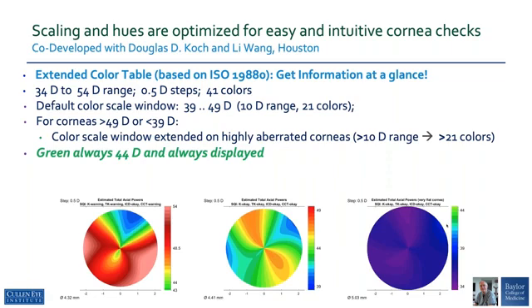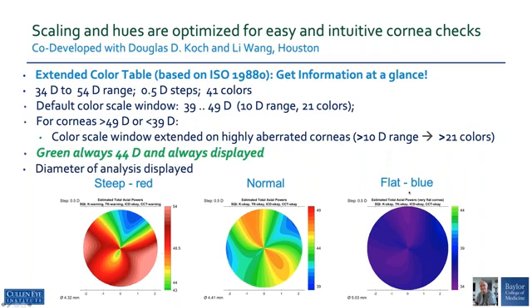Here are three representative maps. In the middle is a normal cornea with a moderate amount of astigmatism — green at 44 diopters — and the typical span of 39 to 49 covers this cornea adequately. On the left is a very steep cornea where green appears near the very bottom of the scale to orient the clinician that this is a steep cornea. On the right is a flat cornea shown in blue, but by displaying 44 diopters in green it still orients the clinician. The diameter of the analysis is always displayed, shown here with blue rectangles, so the clinician knows what portion of the cornea has been measured with the three-zone LEDs.